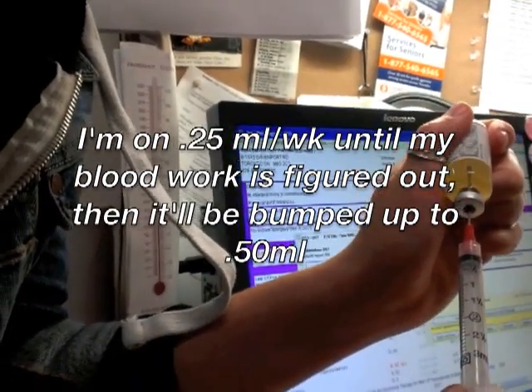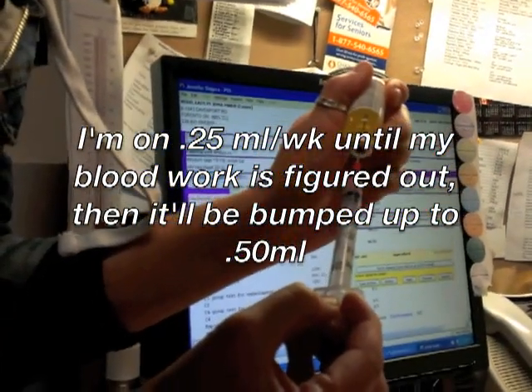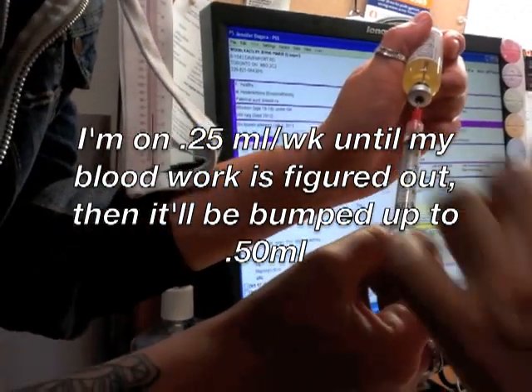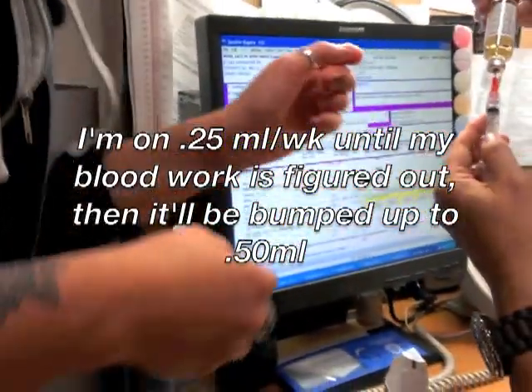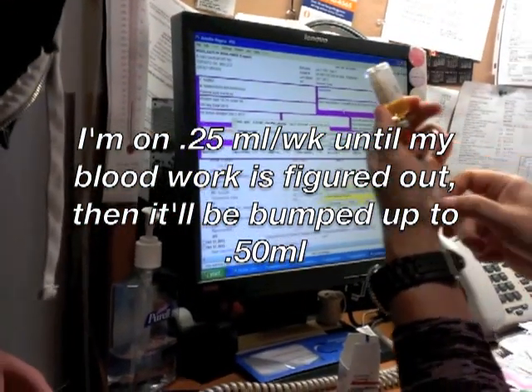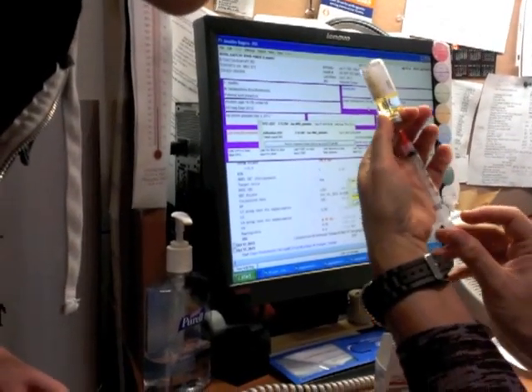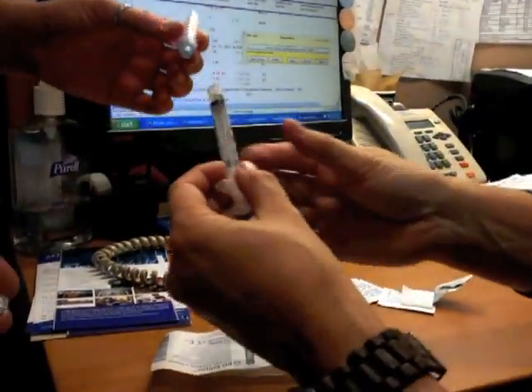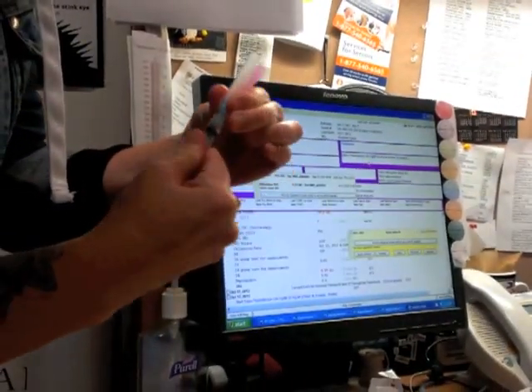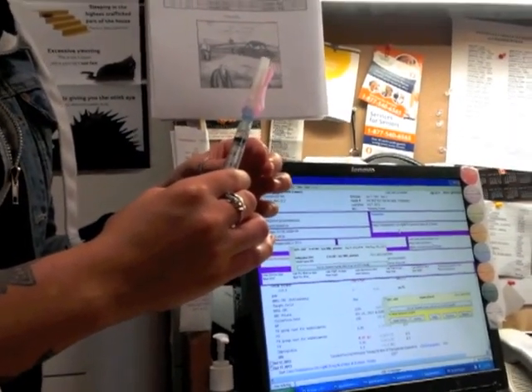I know it's really thick. That's why I give you a bigger needle to withdraw. You're going to go in between the third and fourth line. I know, it's such a small amount. And plus you don't want any air bubbles, so we got one there. I'll teach you how to, we're going to knock that to the end, and then we're just going to push the air back into the bottle, and then you'll withdraw again. Then you're going to screw that on nice and tight. This one's a smaller size needle, so it'll take a little bit of getting used to, but because you're not injecting that much solution, it won't be too bad to inject.